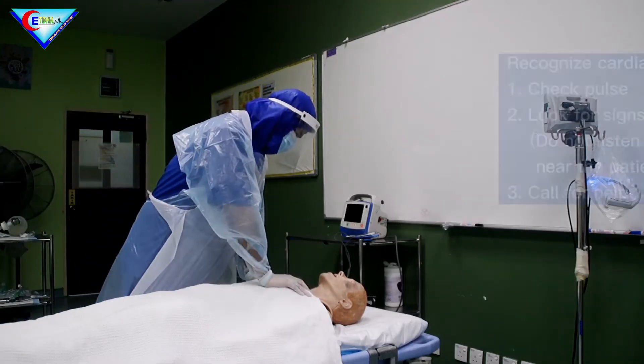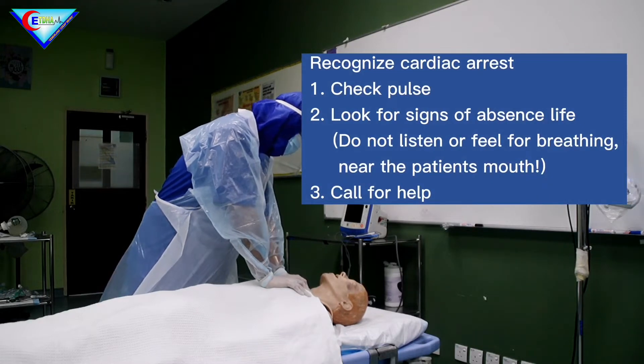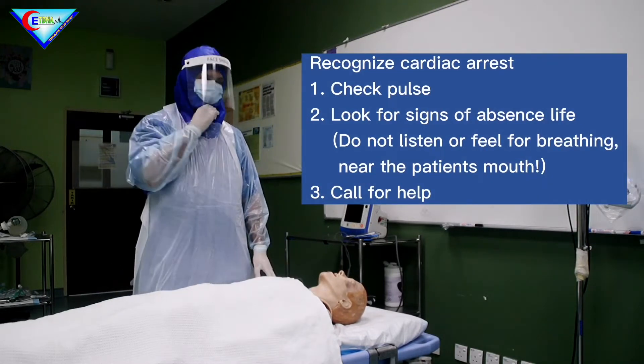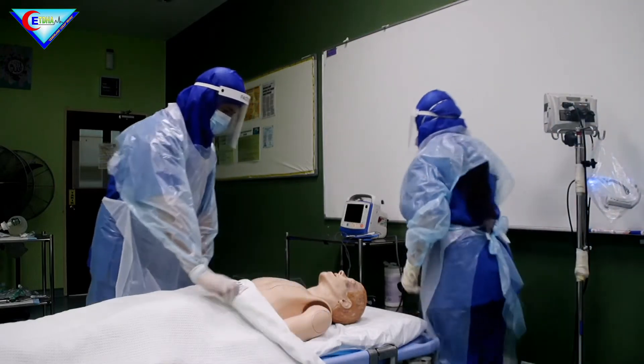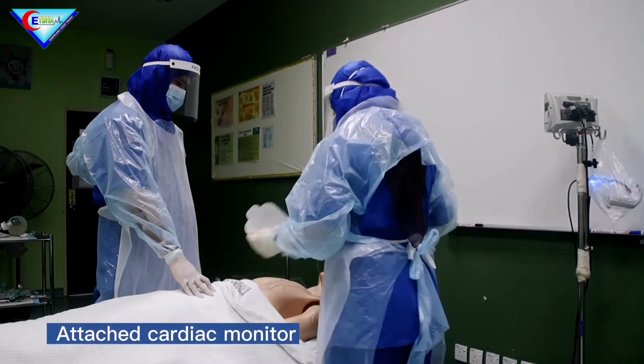Sir, sir — no response. Check for pulse: no pulse. Call for help. Attach cardiac monitor.